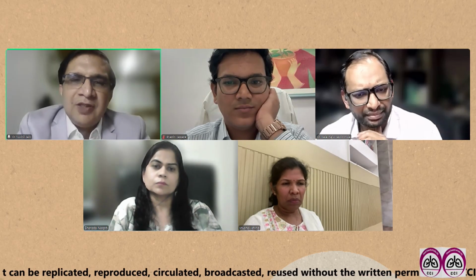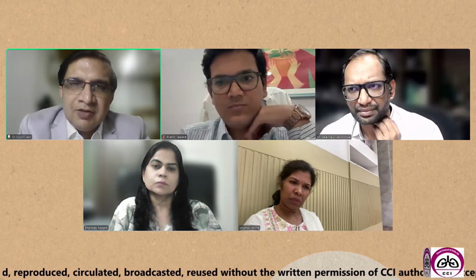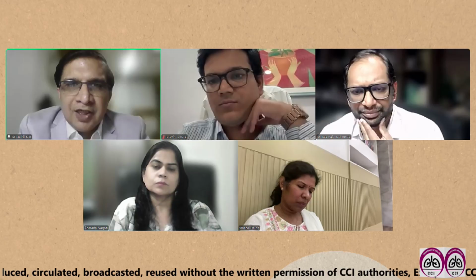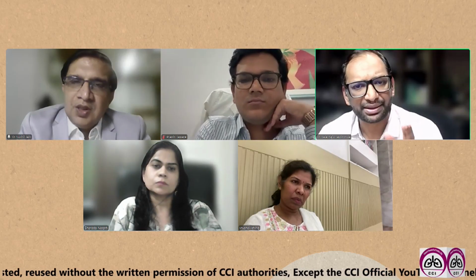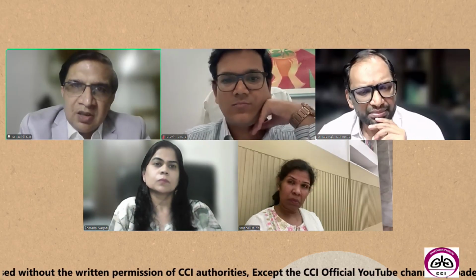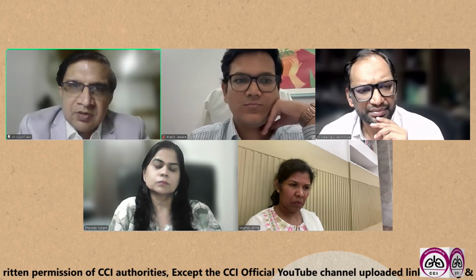With cryo coming in, people are gradually shifting to cryo. If your normal TBNA is not doing well and you're not getting an answer, switch to cryo. I think the next step is directly to cryo, not to change the needle. That's what I have seen in my practice. And as you rightly said, using these newer needles adds a lot of cost to the procedure.